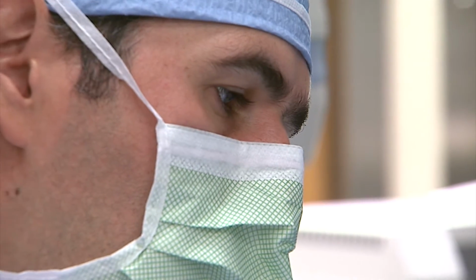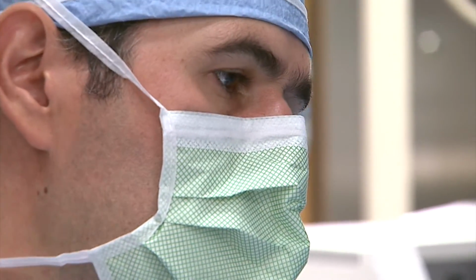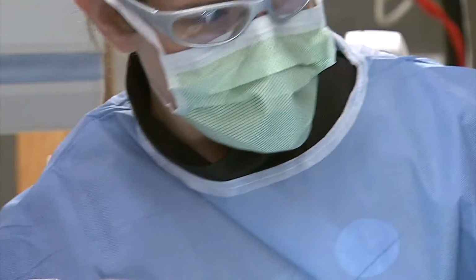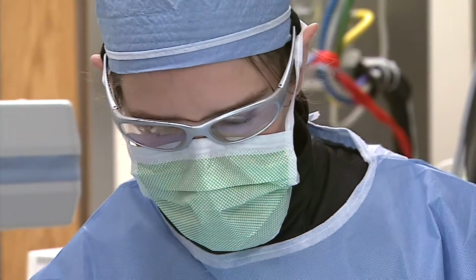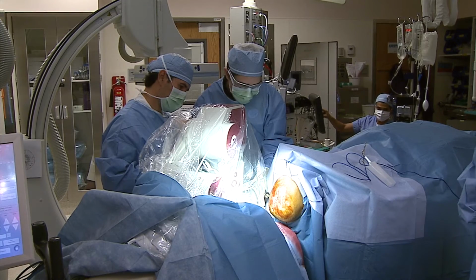So we went there and we followed the electrode that was recording the seizures with the probe. And we performed a little tiny lesion. We're talking about less than 0.5 centimeters. This patient that was having 100 seizures per day completely became seizure-free, and we now have an outcome of approximately 6 months. The combination of a minimally invasive method of localization like the SEEG with a minimally invasive method of treatment with laser was fantastic for this patient.